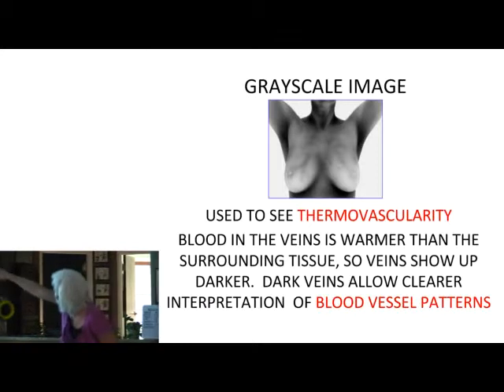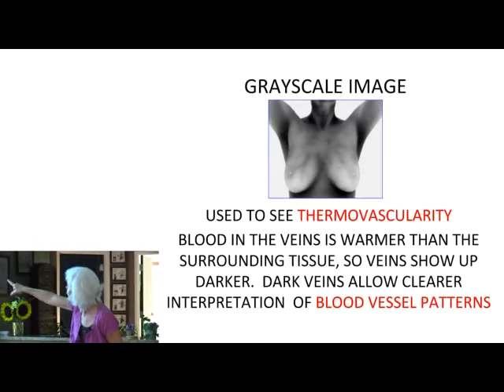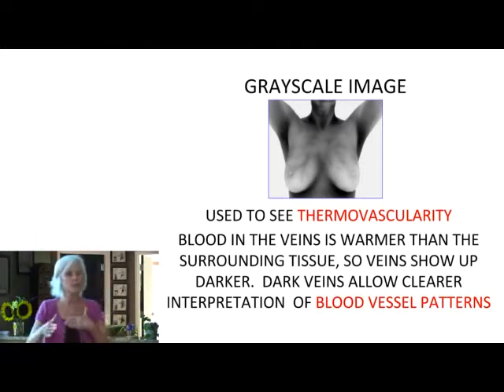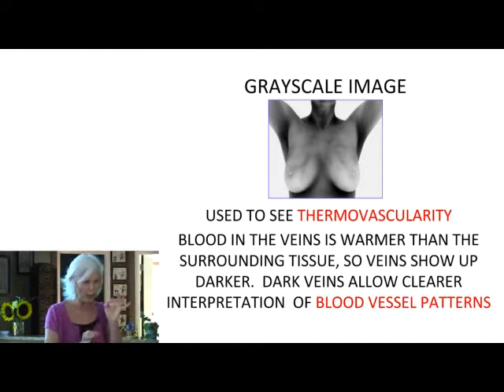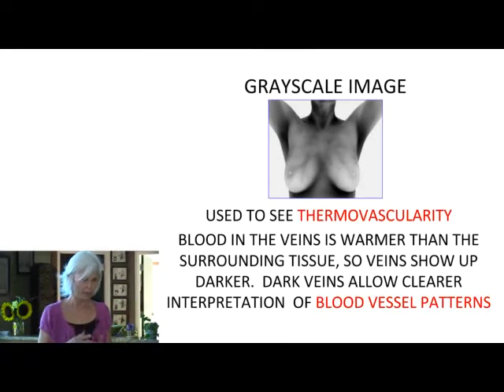But these, see the lines? You see the black and white, the blood vessels? The dark veins allow clear interpretation of how these blood vessels are forming. And if they form a certain way, there are certain patterns the interpreters look for. My doctor Ren, and he's training another doctor here with whom I'm going to be working, who's actually going to be evaluating as well. They're trained in knowing how these blood vessels can form. If it's indicative, it might be feeding something, if you know what I'm saying. Blood vessels form over something if it begins to start feeding something. And so if they're forming in such a way that indicates that, then that's obviously a red flag.